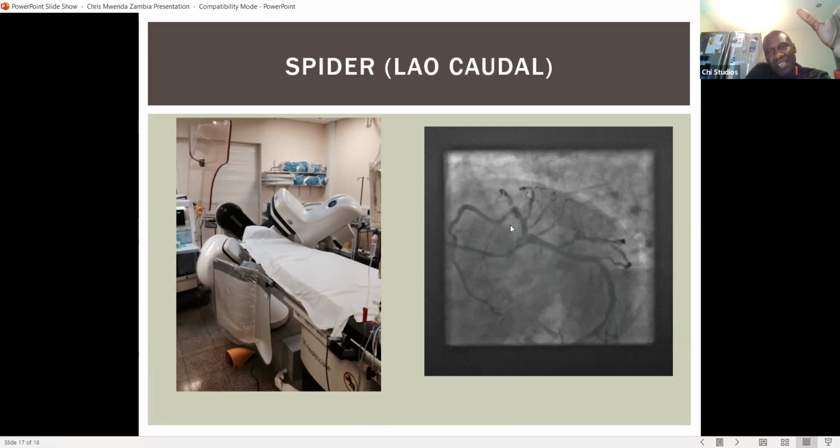And I think we have been discussing this lesion. Even in this view, it tells you this lesion needs to be attended to, needs to be intervened. So that's the area you're going to intervene. When the doctor is struggling to wire, usually what we do, whether it's stents or balloons, whatever the vessel we use, we'll put a wire which will go into the vessel we are intervening. So this is the best view the doctors will use.